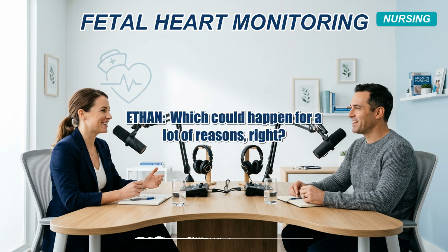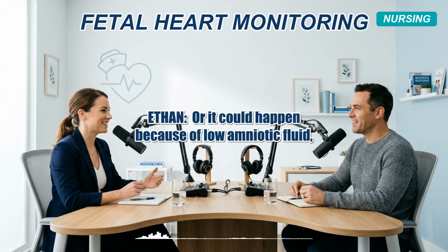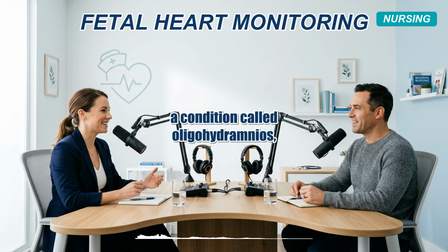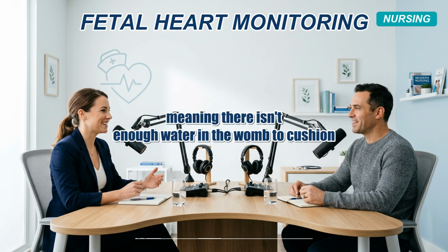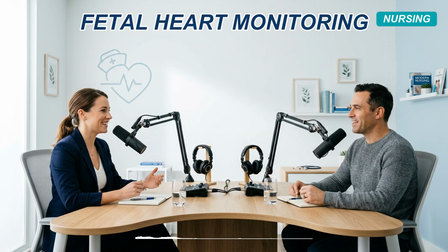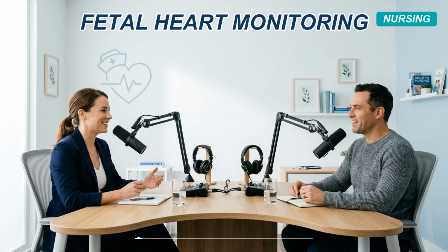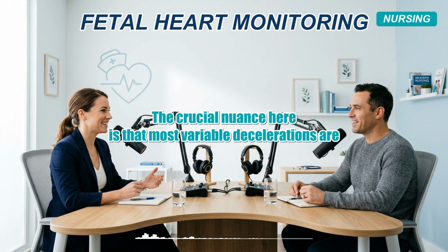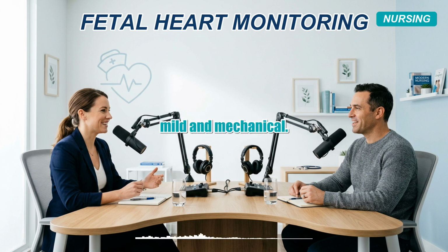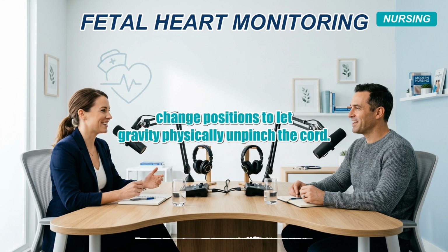Which could happen for a lot of reasons, right? Could be a nuchal cord, where it's wrapped loosely around the baby's neck. Yes. Or it could happen because of low amniotic fluid, a condition called oligohydramnios, meaning there isn't enough water in the womb to cushion the cord from being squished against the uterine wall. It could even just be the physical position the baby is in as they descend. The crucial nuance here is that most variable decelerations are mild and mechanical. You can often fix them simply by having the mother change positions to let gravity physically unpinch the cord.